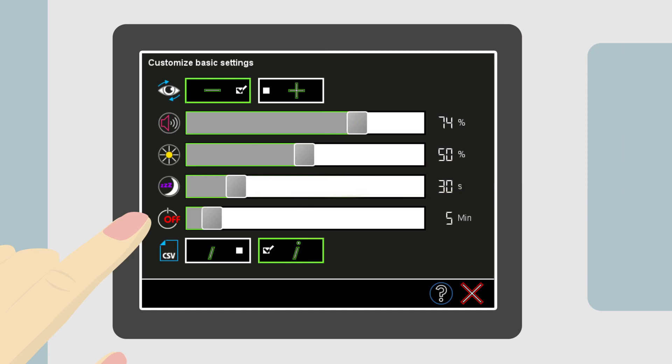Anna will need to remember to manually turn off the device when she is done. The last selection is the separator for data import and export.